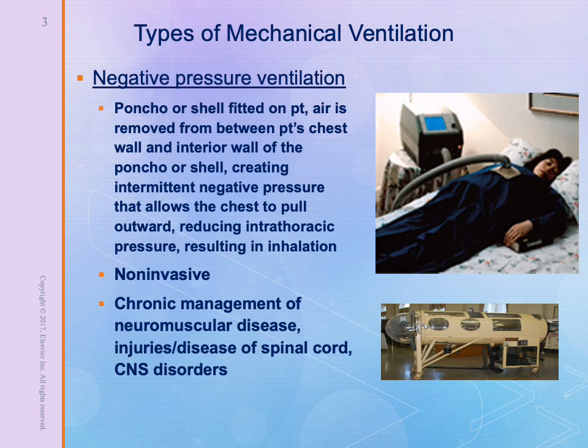The negative pressure from these machines assists the muscles of the chest and the diaphragm by actually pulling the chest outward, thereby giving the patient the extra help that is needed to physically inhale. And then exhalation will happen passively.